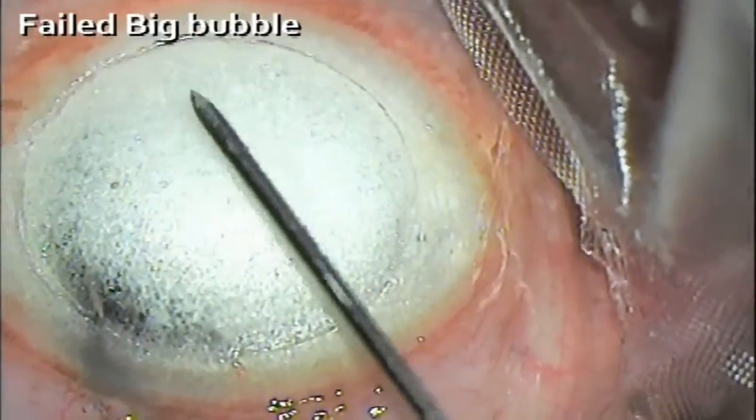What to do when the big bubble is not formed? Shall we convert to penetrating keratoplasty, or is there any other way we can preserve the Descemet membrane and the vital layer of the cornea? When big bubble fails, what helps?